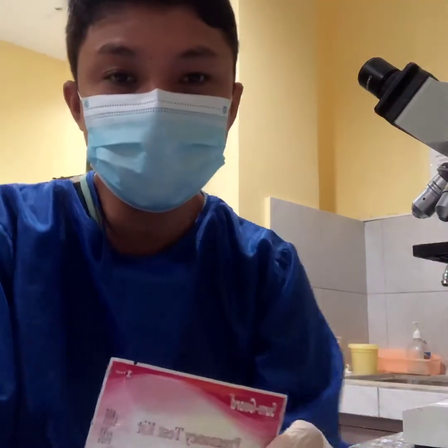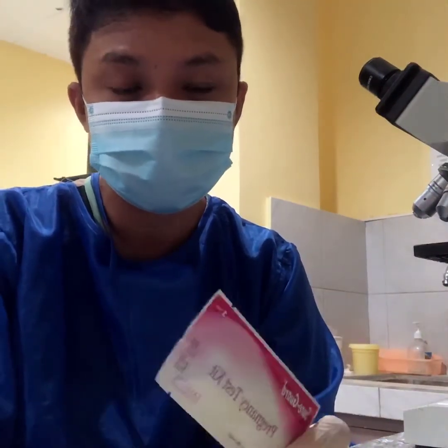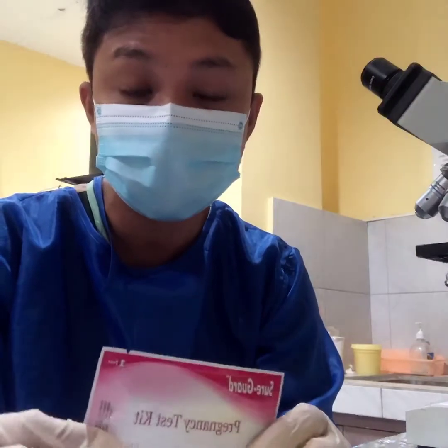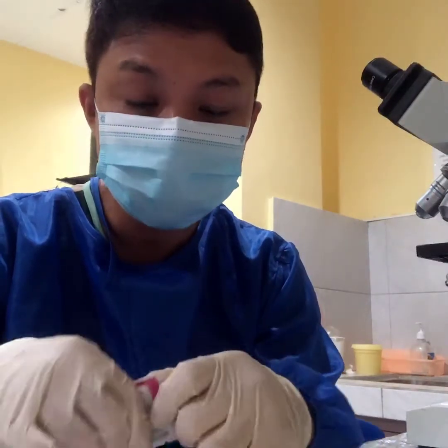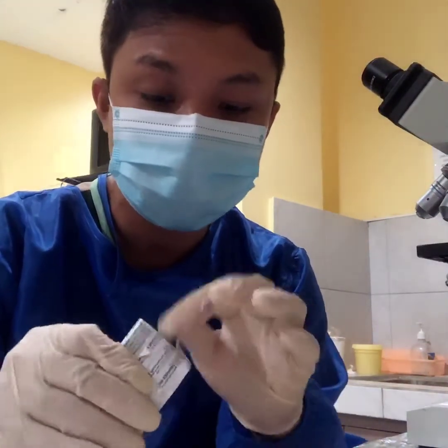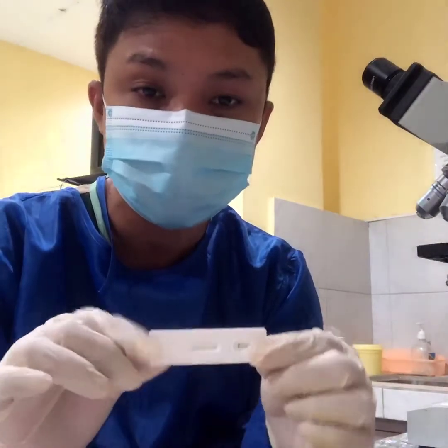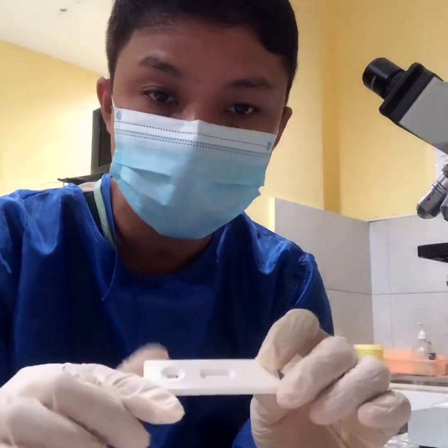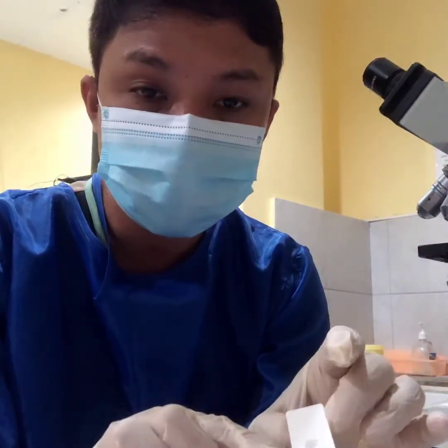Okay, today we'll be doing the pregnancy test. This is one example of an immunoassay using a rapid test kit. The rapid test kit, just like our pregnancy test kit, makes use of a test cassette. Basically, our test cassette has the test line.